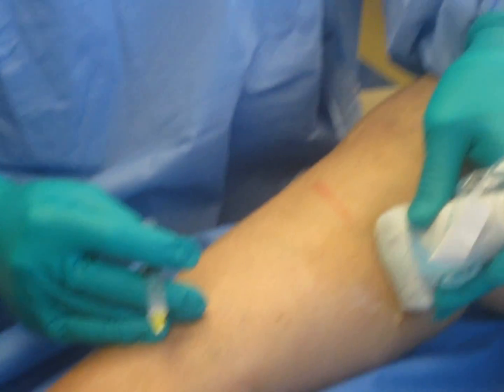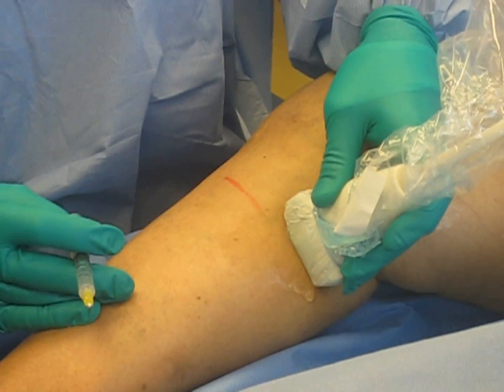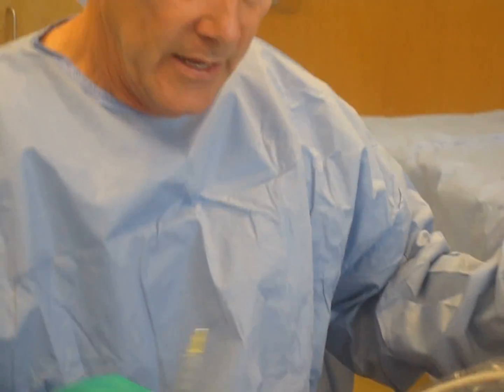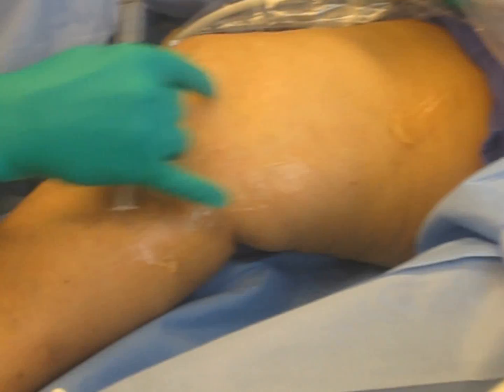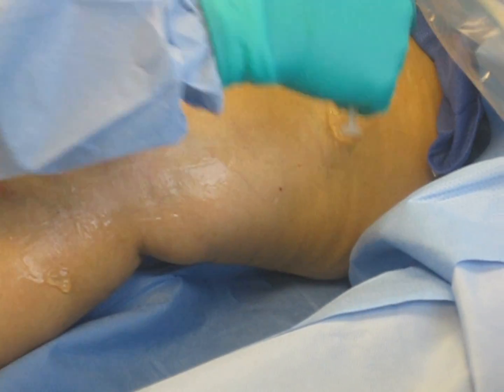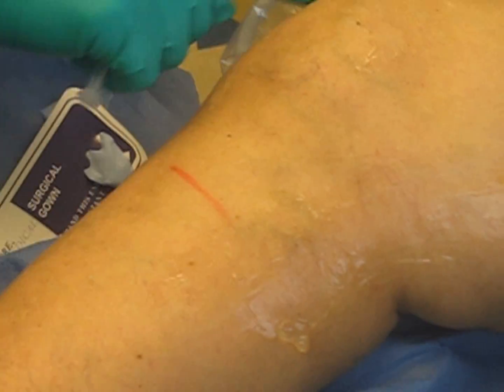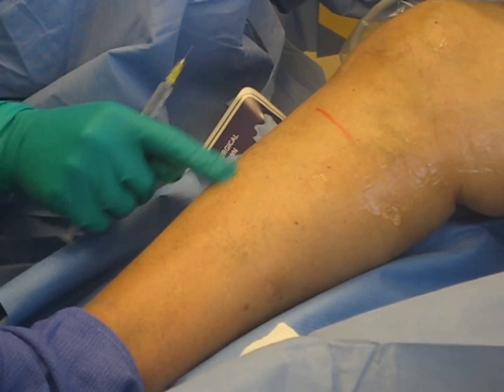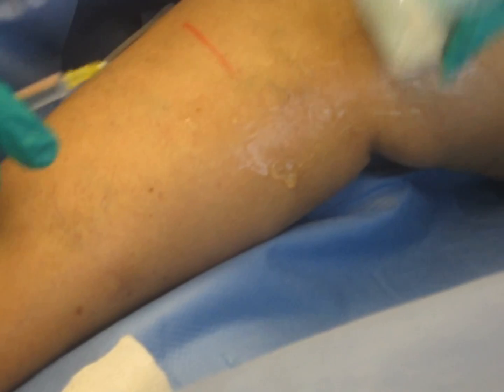We're starting our EVLT — an endovenous thermal ablation of a right great saphenous vein. This patient's right great saphenous vein goes up the inside of the thigh; these branches feed into it and it turns into the deep vein. The valve at the junction of the superficial and deep vein is broken, allowing blood to go down the leg. You can see all these varicose veins, and she has some skin changes starting. So we're going to close that vein.